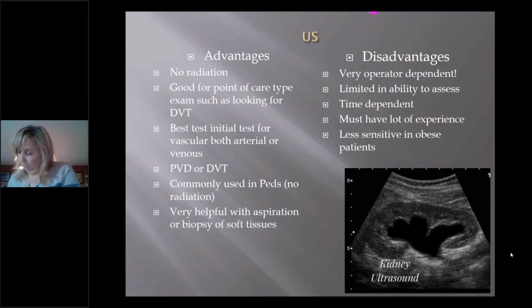So what are the disadvantages? As I said a moment ago, very operator dependent. Limited in some ability in terms of where you can get to. It's hard to get to small areas and it's hard to get to people that are a lot heavier, in terms of being able to see the detail well. Time dependent, a lot of experience, and again, less sensitive in obese patients.